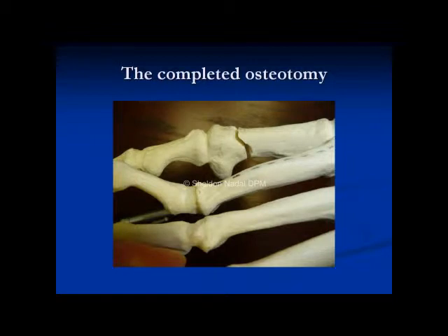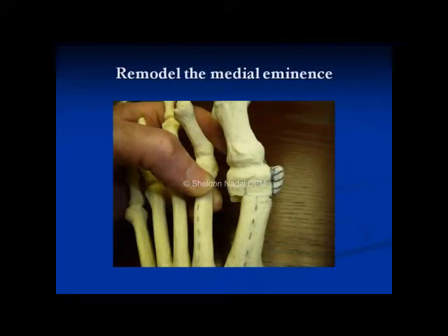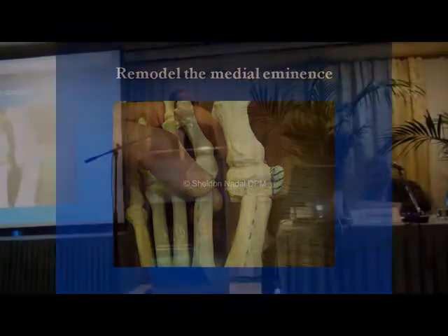The only thing I do slightly differently is the inferior cut, I try to angulate slightly distally, just short of the sesamoids, because by making it a little bit more distal angle, it locks it in better and contributes to more stability. Then you displace the capital fragment laterally. And before you might have removed this entire bump, but then you would have a big proximal shelf. So you remove a little bit of it, push it over, and then you can remodel whatever is left once you've displaced it.